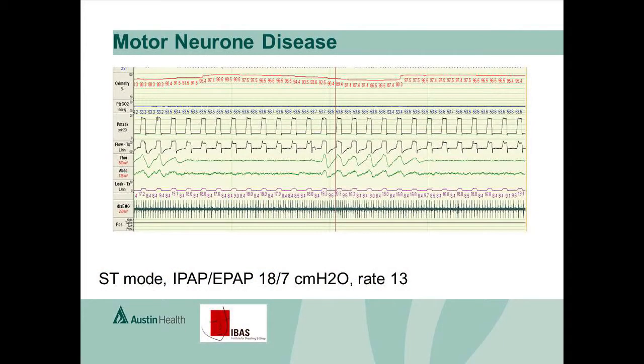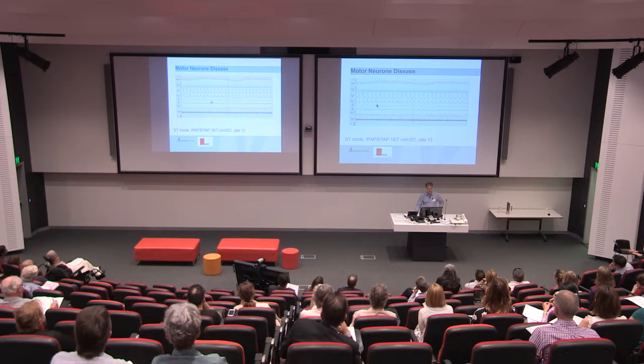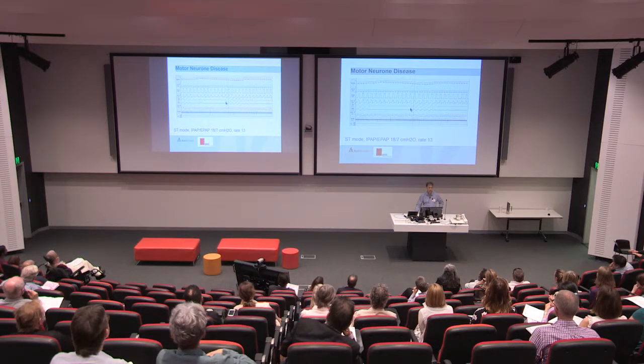Now let me show you something different. This is a time when that's not occurring. You're seeing the oxygen level up here is good, 98, but falling down to about 86, which is moderately reduced. This is the ventilator chugging away here, pumping out breaths. But down the bottom, you can see there's just no movement of the chest and the abdominal wall for this prolonged period of time, about 40 seconds. And then it starts to coordinate again, and then it goes off again.